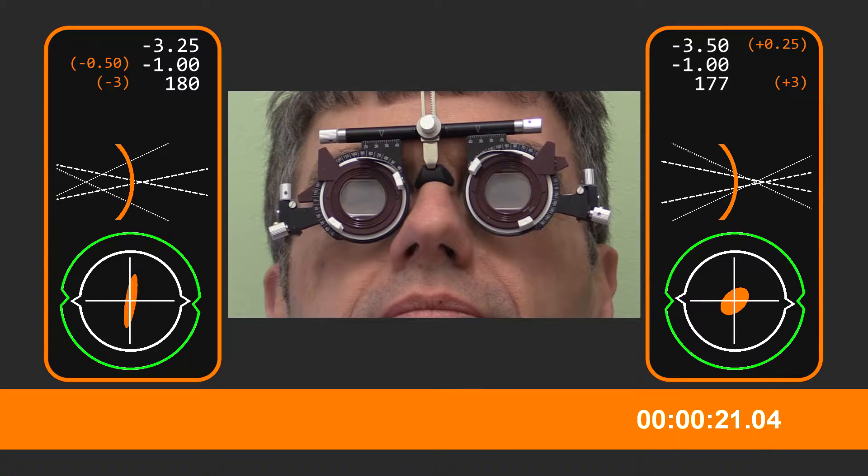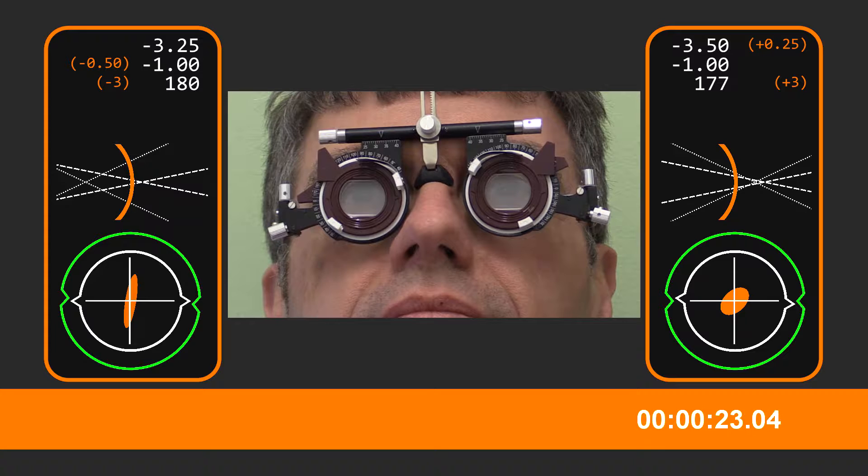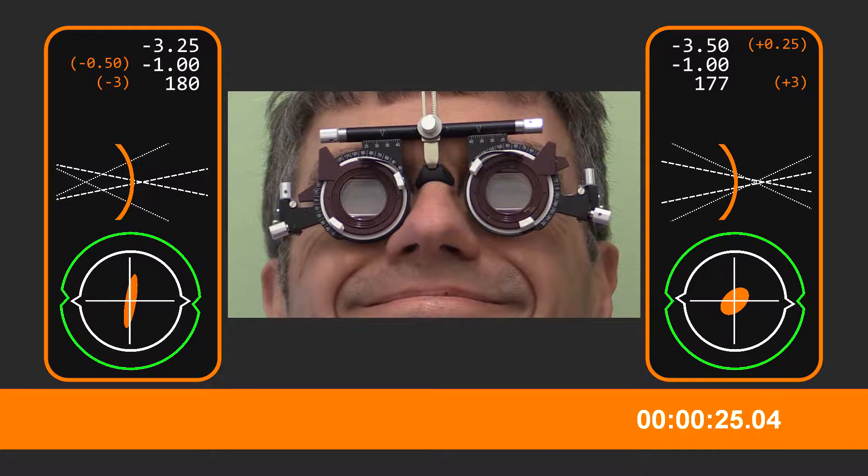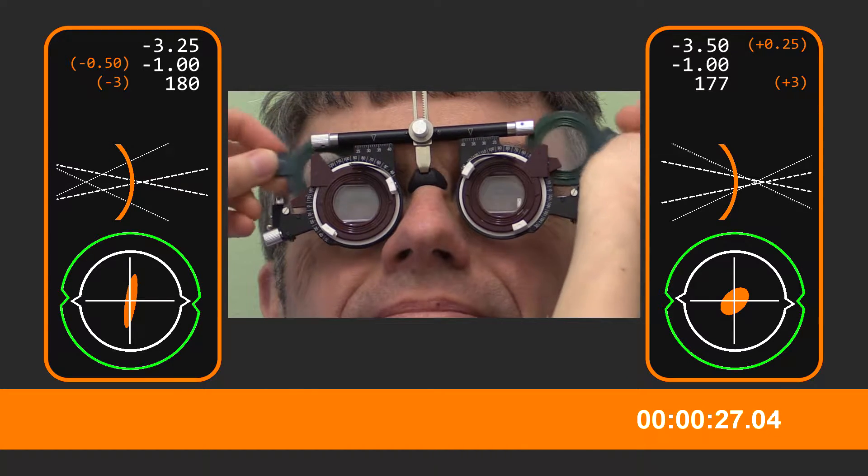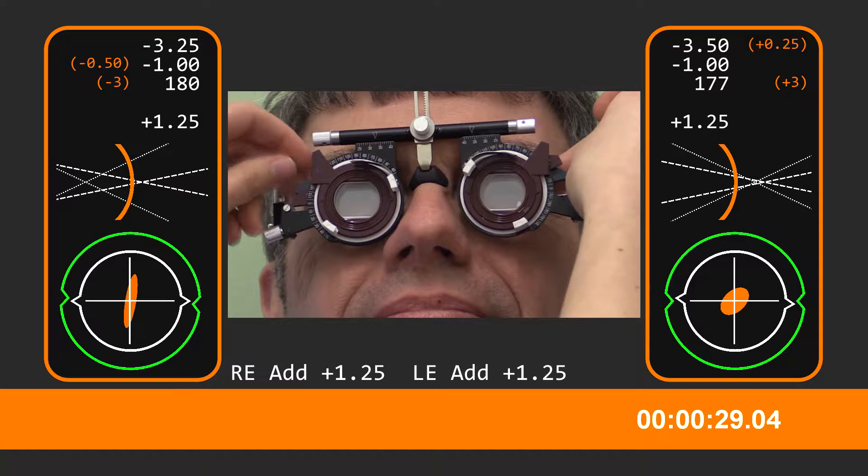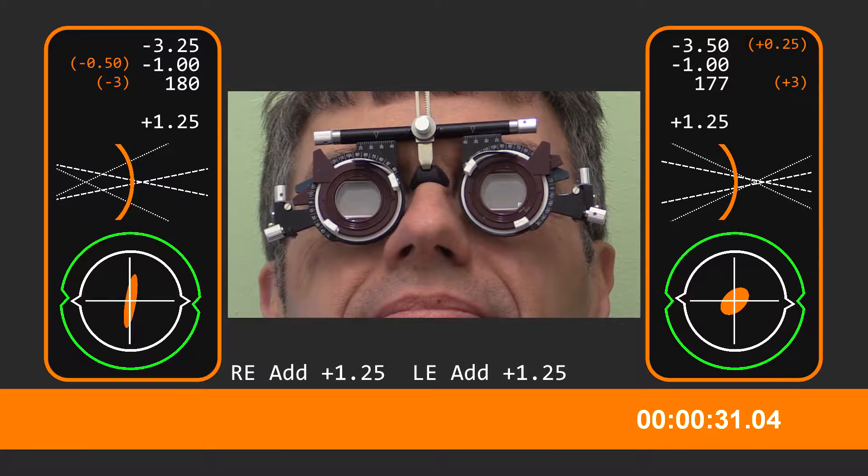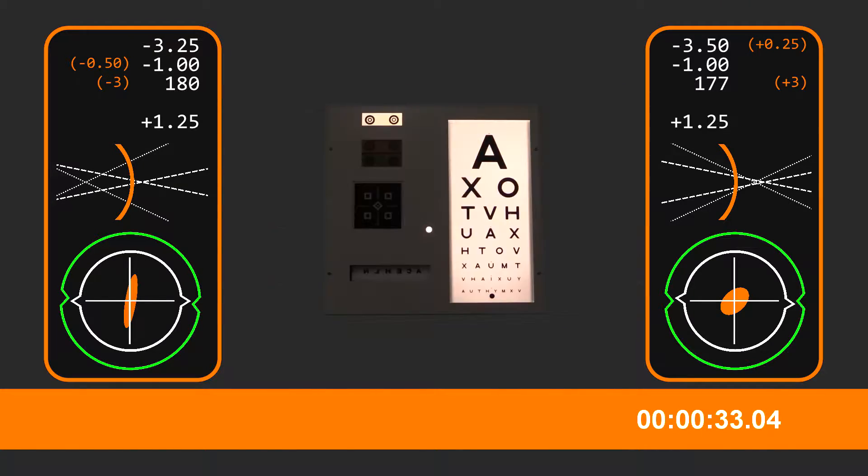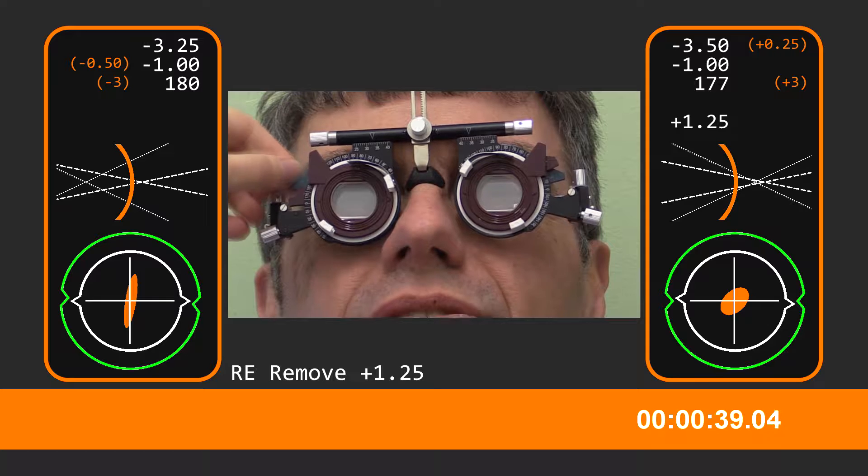And this time I'll attempt to do my binocular balance so you can see the difference between the two too. So we're going to pop those in place there. What's the smallest you can see now? Well, maybe V, O, T, H, maybe T, M, U, A, X, that's all. That's okay.